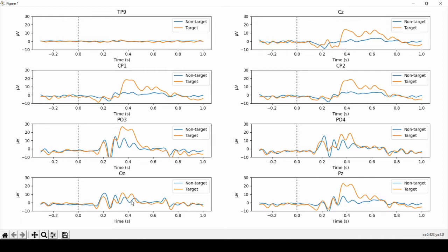Moving closer to the positions of interest, going over to PO3 and PO4, the effect starts to become a bit more clear, so the difference between the graphs.